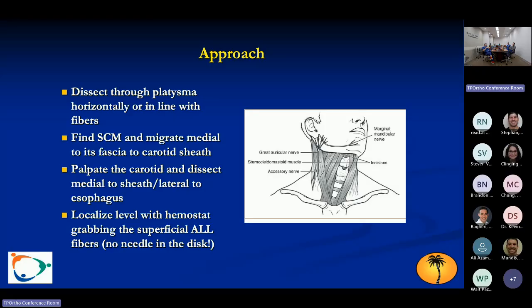As you work under the platysma, use the retractors a little bit to lift up, and you'll create a little bit of a plane differentiator by doing that. And you know that, but you doing many approaches, it's the same thing. If you lift up on the skin or the superficial tissues a little bit, it starts creating a little more three-dimensional clarity below that, and that'll help you find your way. And you can use your finger as well, but people's fascial planes differ quite substantially. Some are very rigid, some are supple, and you can kind of move through it easily, but lifting up will help you.